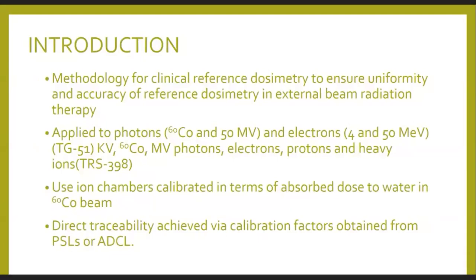Yet TRS 398 has even more calibration procedures for low energy photons and protons and heavy ions. This protocol is based on usage of an ion chamber calibrated in terms of absorbed dose to water.